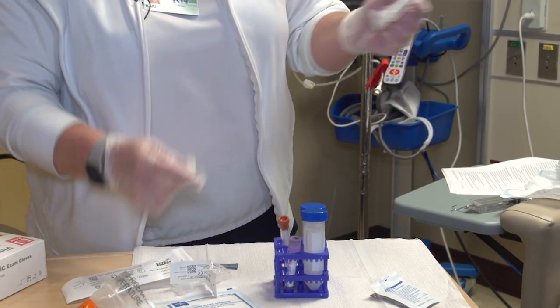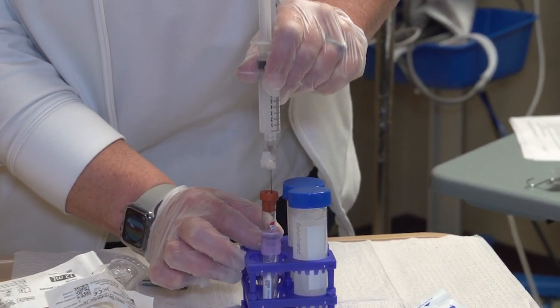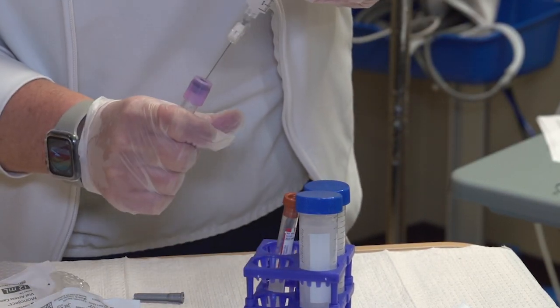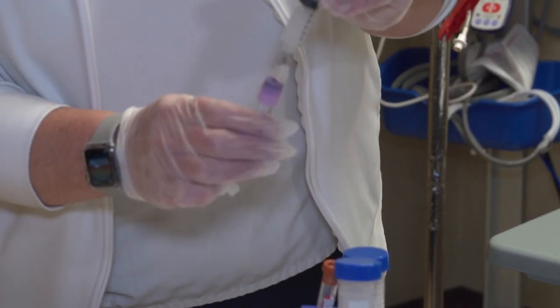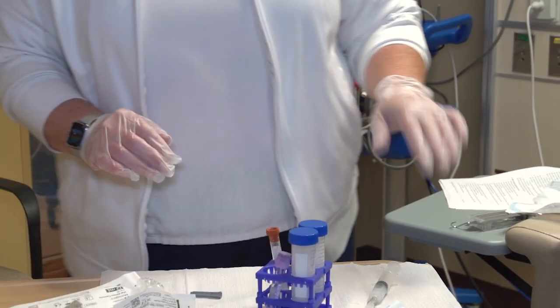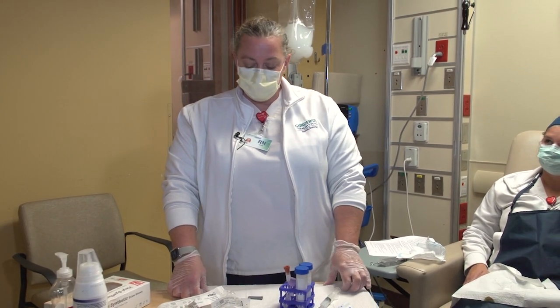The blunt will fit into the lab tubes. And then you just fill your tubes. Discard. Put your labels on your tubes and hand deliver these to the lab and let them know you have stat cell counts to be done.